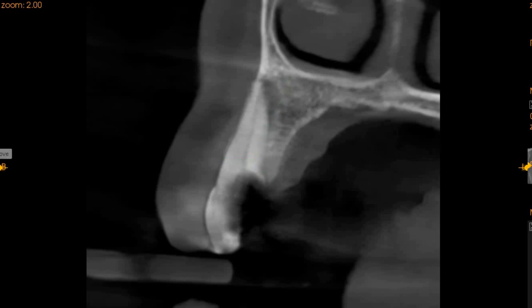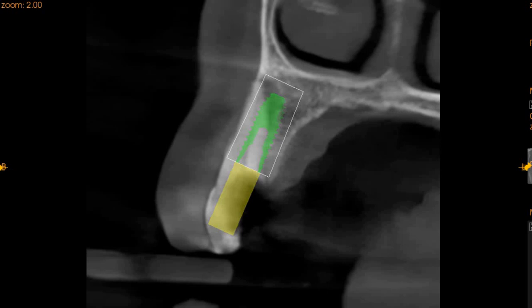We have placed a virtual implant simulation as requested by the doctor. On the implant surface, we can clearly see that a 4.0 by 11.5 implant can be placed after immediate extraction. You will have sufficient bone for connection during the implant placement.